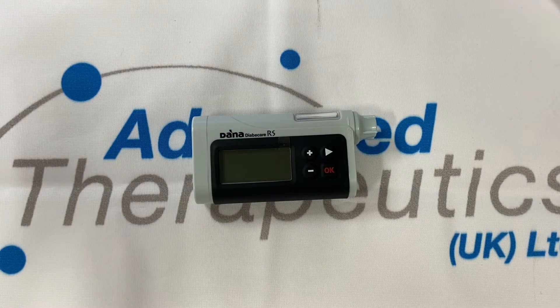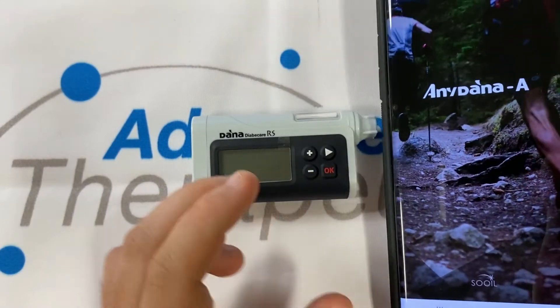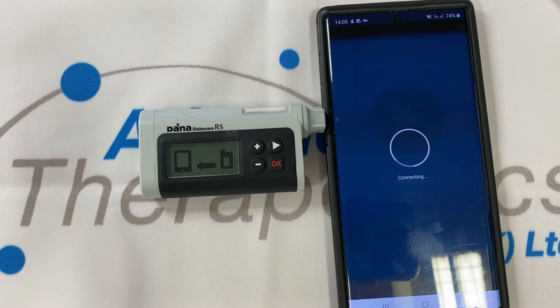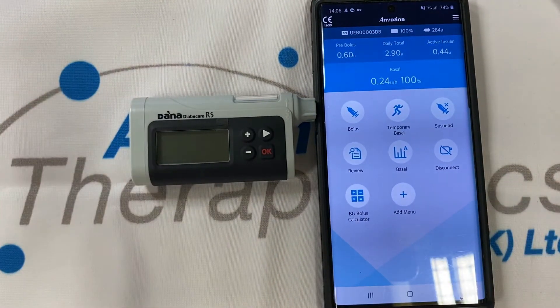After pairing your pump to a phone, using our app is incredibly easy. Use a fingerprint scanner to connect, link up your pump and in just two seconds you'll be able to use your phone as a controller.